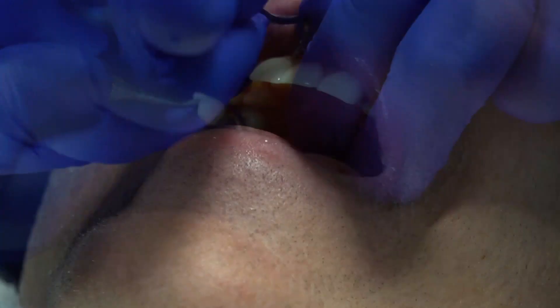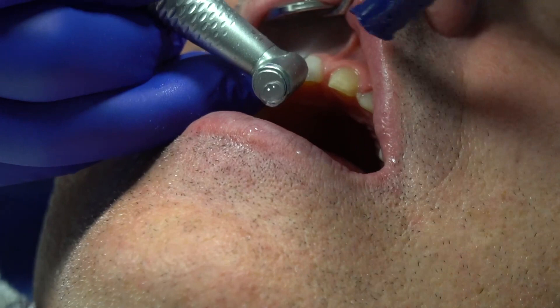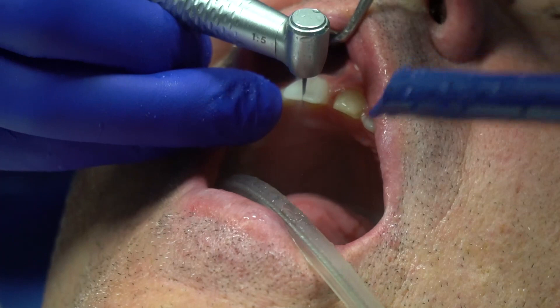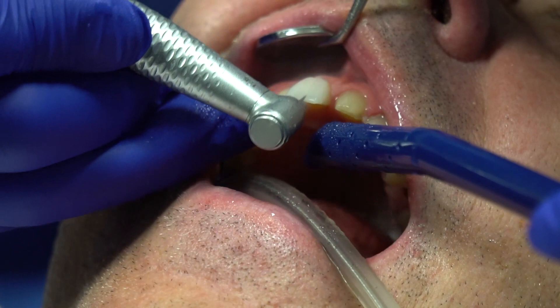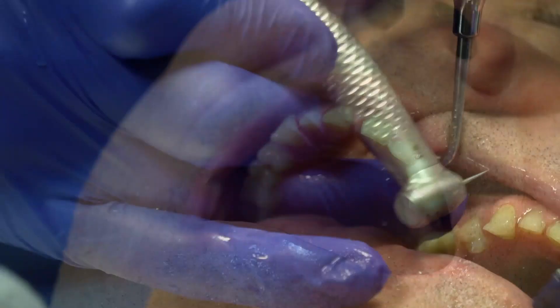That one doesn't want to come off, so what I'm going to do is make a mid-facial cut. Since I know I can go down that deep, I'm going to go down and try not to hit the tube, and then take the Shure instrument. There's composite right there, so I'm definitely going to have to take that off.